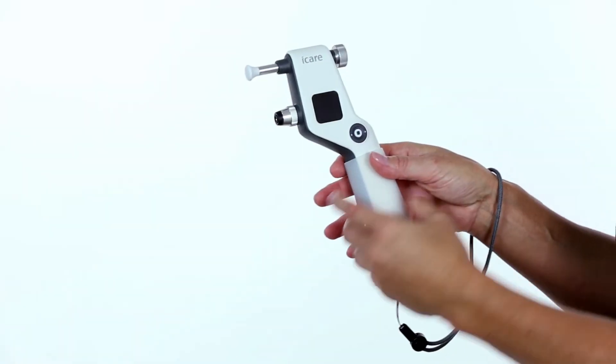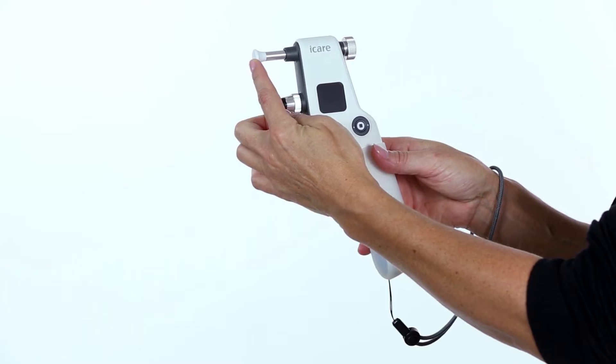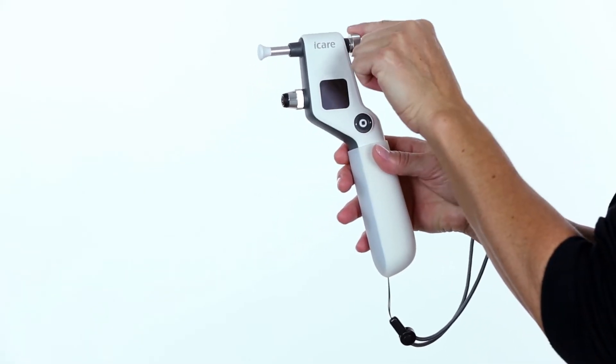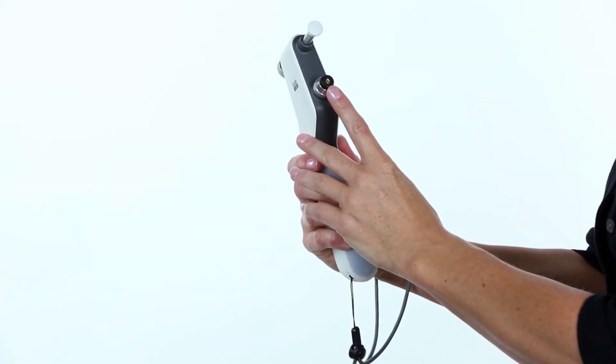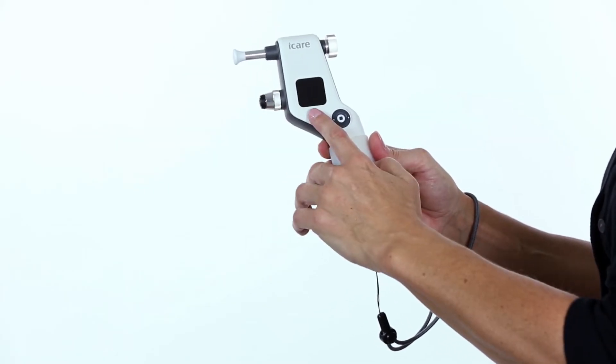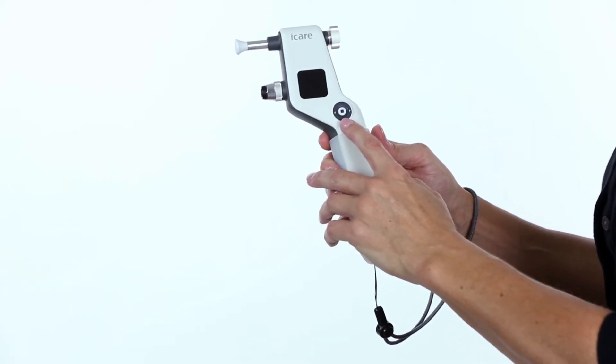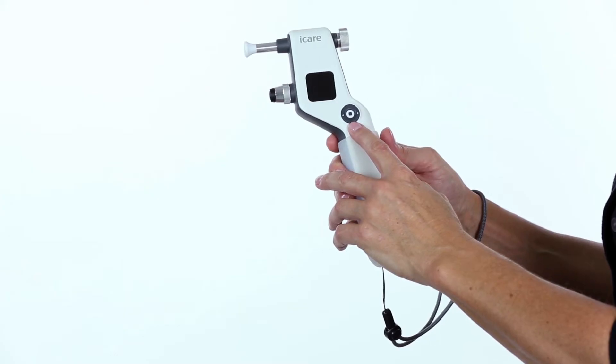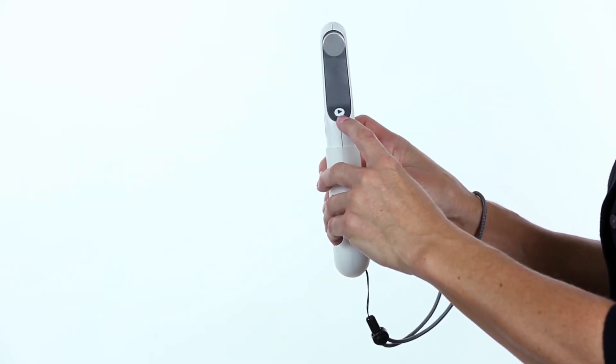Parts of the IC-100: This is the forehead support, forehead support adjusting wheel, probe base and collar, display, select a navigation button, and the measure button.